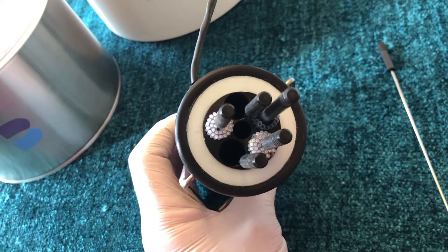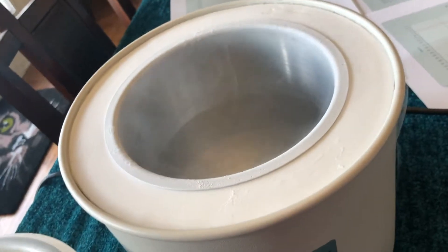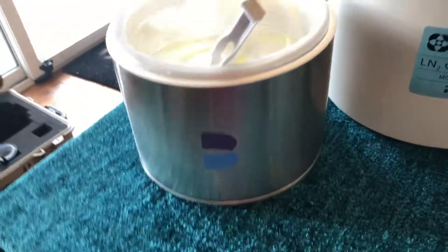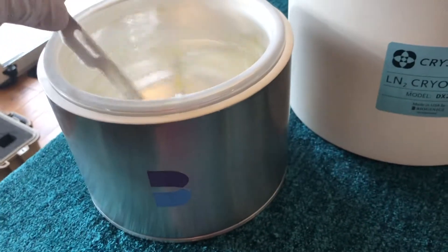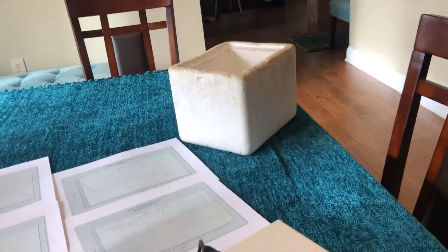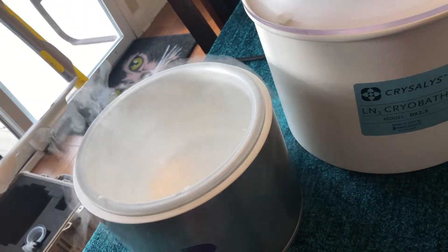To do this operation we're going to need the Chrysalis DX 2.5, which holds 2.5 liters of liquid nitrogen in an aluminum inner vessel. This is a vacuum-evacuated, very spendy liquid nitrogen vessel — we're sort of in Hollywood here with the video — but you can just as easily use a styrofoam box. Either way, it's just used to hold the dipper that we're going to use to pour liquid nitrogen into the core.